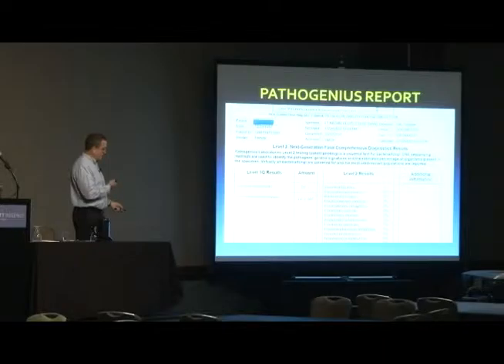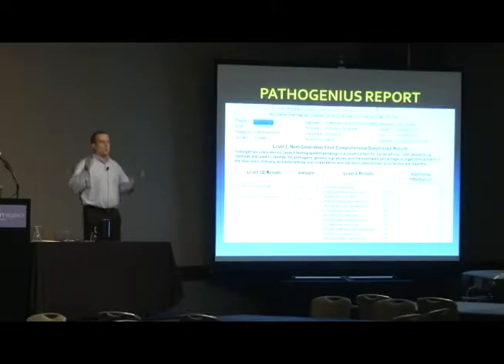So the issue that we get asked a lot about is, okay, are all these microbes, do I really need to worry about these? Are all these, quote, pathogens? The term pathogens is probably going to be modified or significantly changed in the coming years. And there's been papers in the journals now saying that we shouldn't even use it anymore.